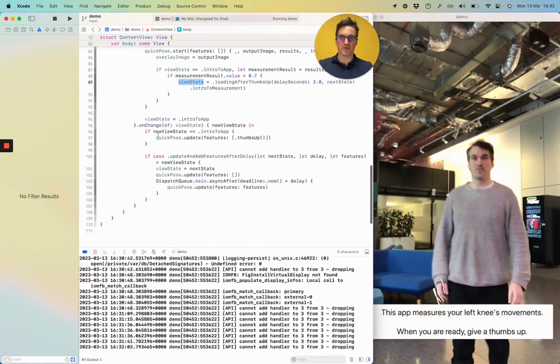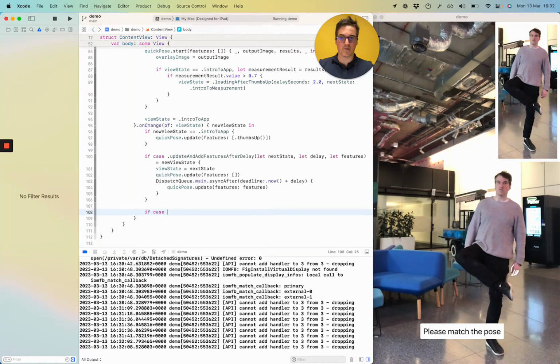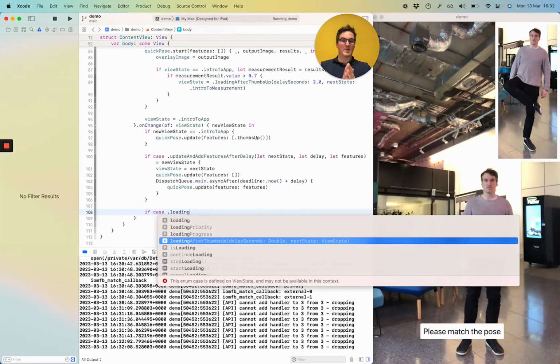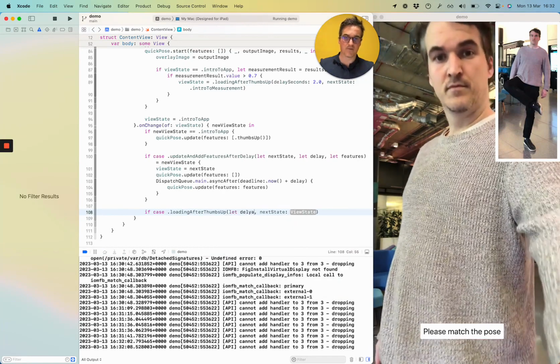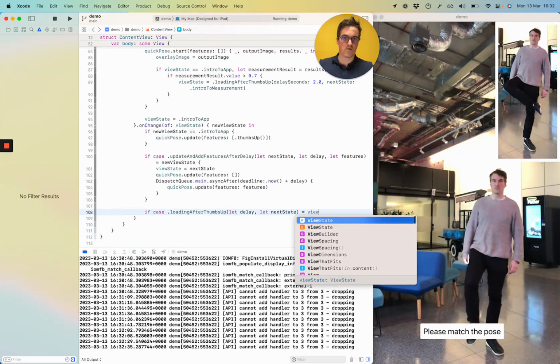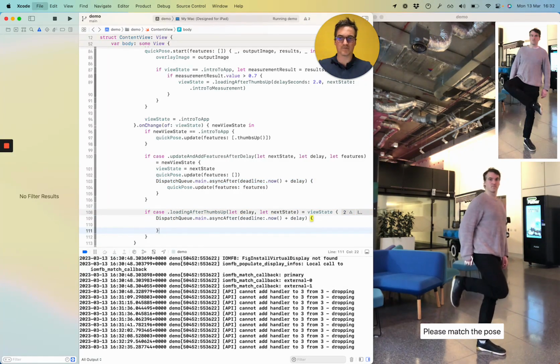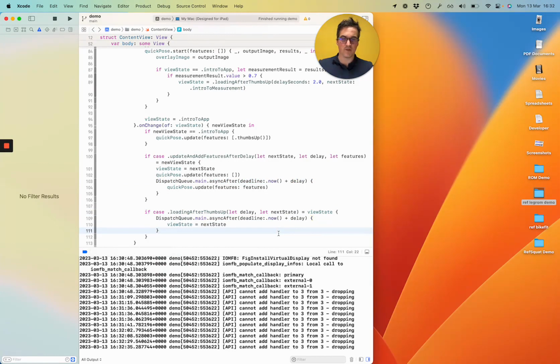So every time we change the state to loading after thumbs up, we want the thumbs up to display a message, which it will do at the top, and then we want it to progress to the next stage. So this is just going to bring in a delay, and it's going to bring in a next state. Okay, I'm going to use this logic here to show the delay, and then view state becomes next state. Cool, okay, let's have a look.